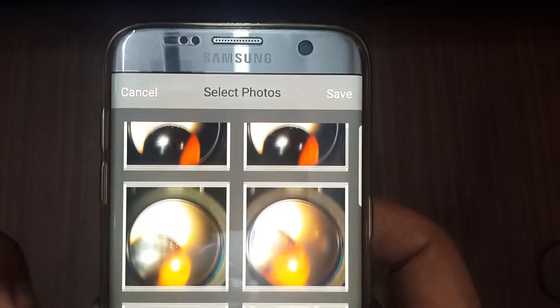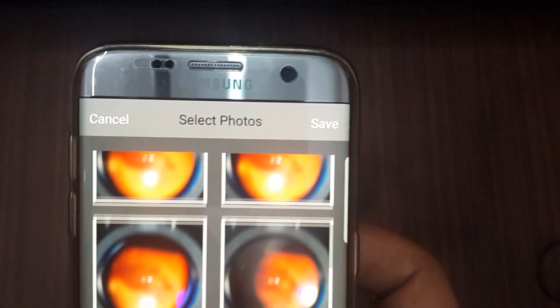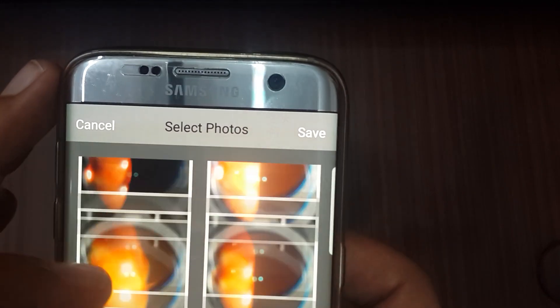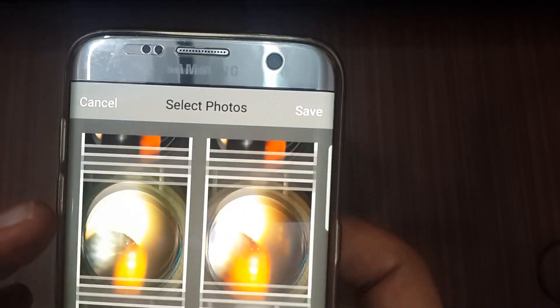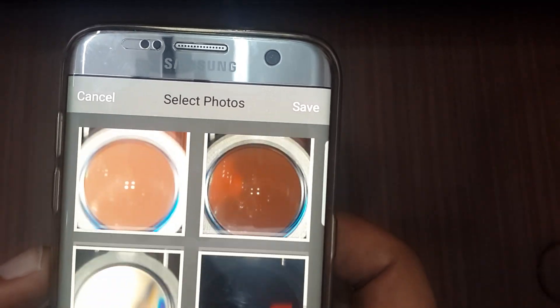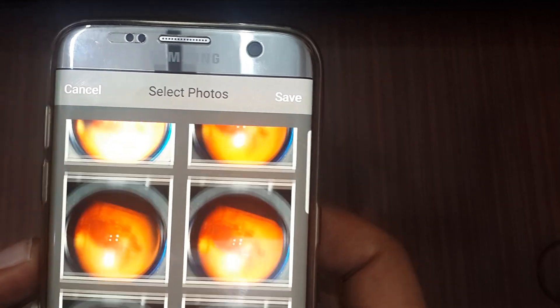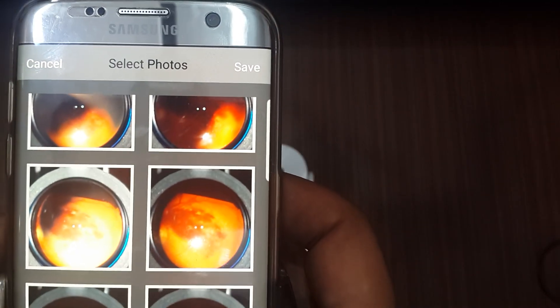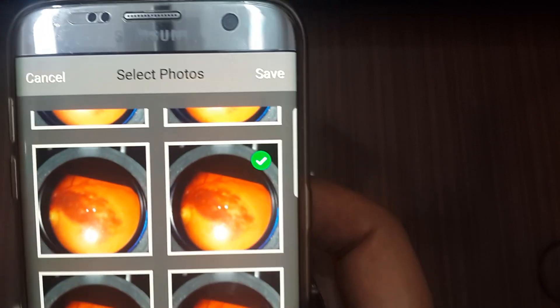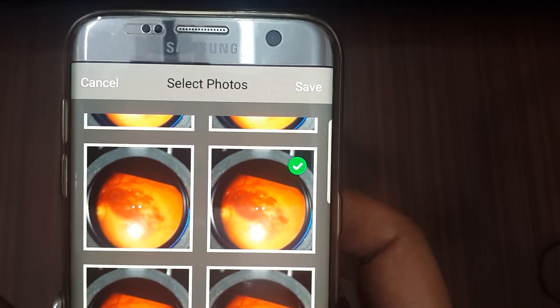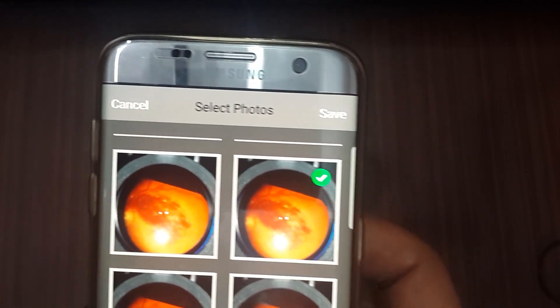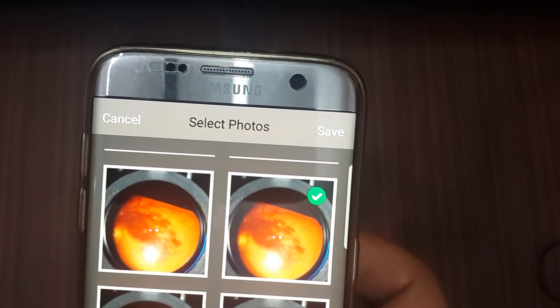These are the captured photos. Some of these photos are not okay as they are still autofocusing. This one is okay, this one, this one — you can choose multiple photos. We can find here that the disc is on the left, meaning the image is reversed.